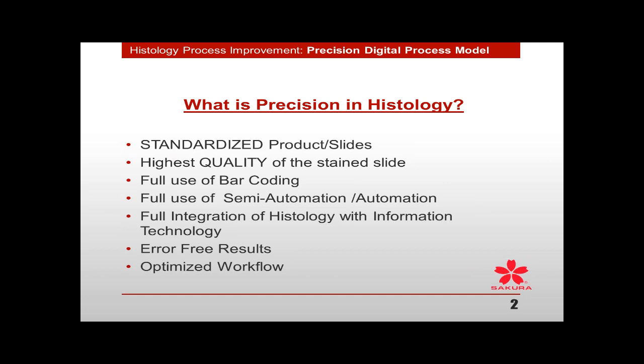It's not going to be enough that you've got reporting software anymore. You're going to have to learn a little bit more about what your technology is, your IT, how you're going to affect that. You're going to have to also work towards, again, error-free results. If you have issues with your slides, you're going to have issues multiplied through this integration, and I feel that the defects and errors can almost have an easier path to getting out to the pathologist and out past us.